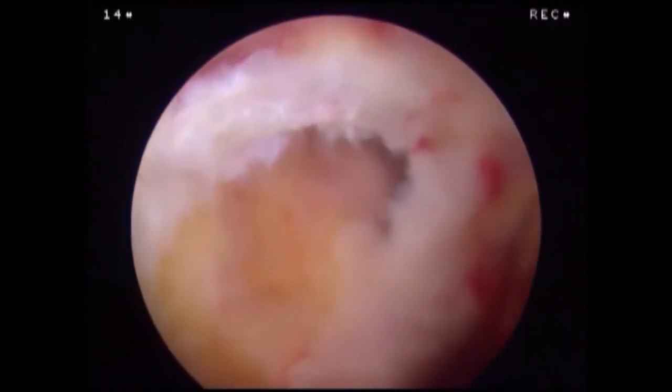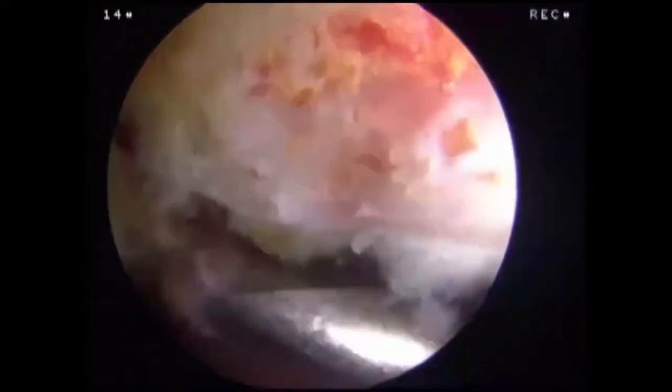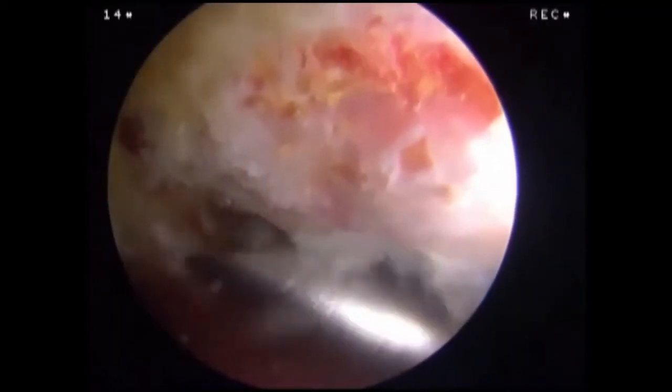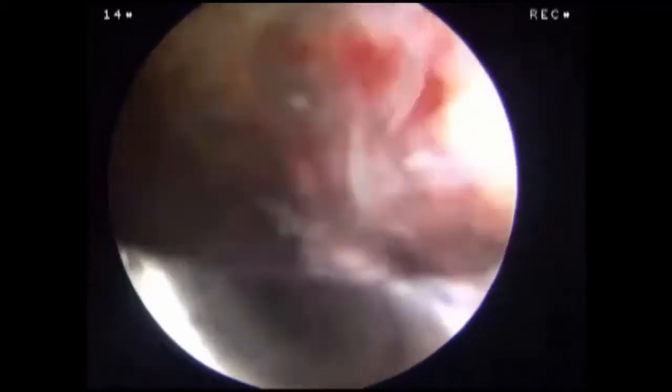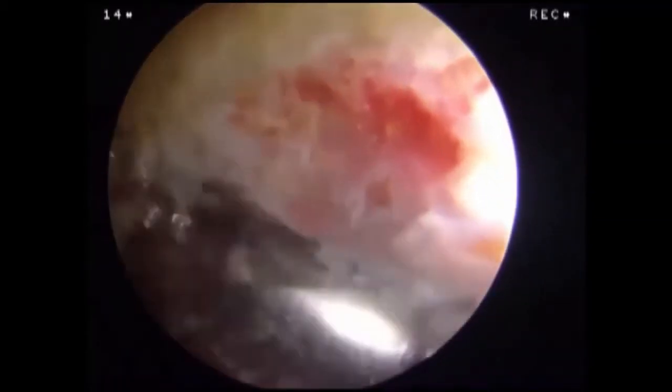The arthroscope is placed in the lateral portal. The rotator cuff is visualized and the tear pattern is assessed. A high-speed burr is introduced through the posterior portal and an acromioplasty is performed using a posterior cutting block technique. The acromioplasty is complete when the acromion is flat and the clavicle is visualized.